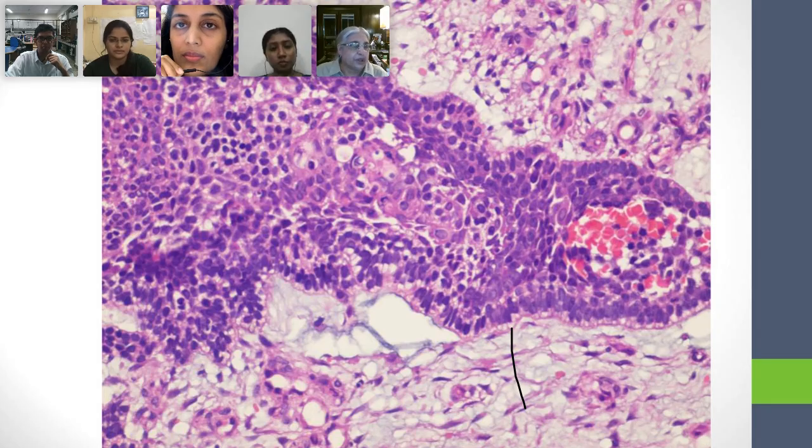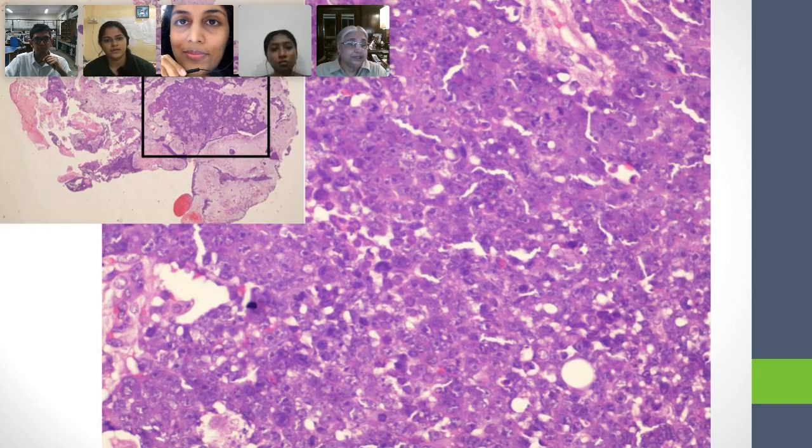So, where does the question of dysplasia and all of this come in? We are not looking at squamous epithelium. We are looking at another epithelium which is showing squamous differentiation, and that epithelium is ameloblastic epithelium. So now we know what we are dealing with. What are we dealing with? If there's ameloblastic epithelium, it has to be an ameloblastoma. But something else has happened in this ameloblastoma.